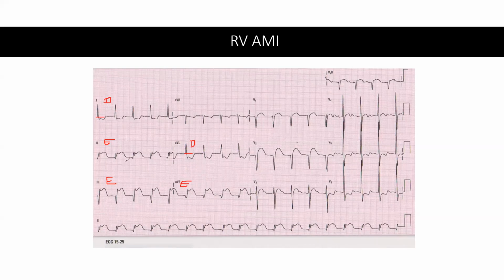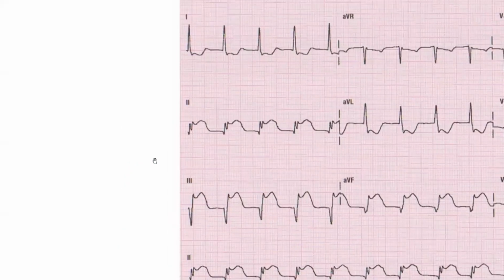Would you measure the ST elevation in lead 2 and compare that to the ST elevation in lead 3? How many millimeters is it elevated in lead 2, and how many millimeters is it elevated in lead 3?